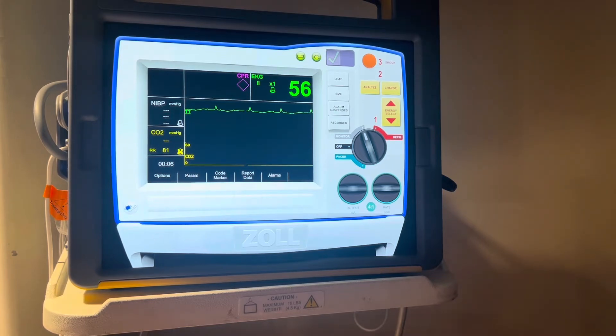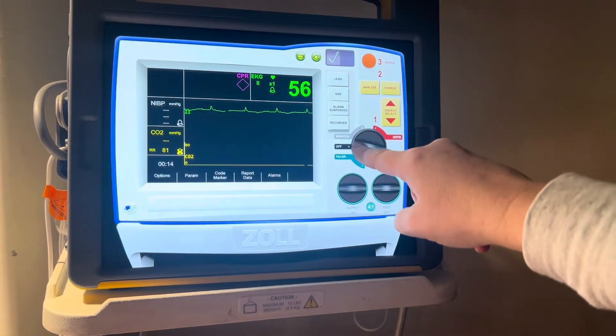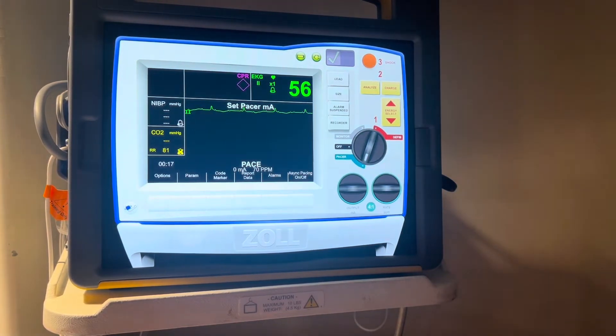Because we are going to pace, we now need to turn on our pacer. With this Zoll defibrillator, you do that by turning the dial down to the green portion where it says pacer. At this point, you're going to choose the heart rate, or the rate that you want to feel a palpable pulse.